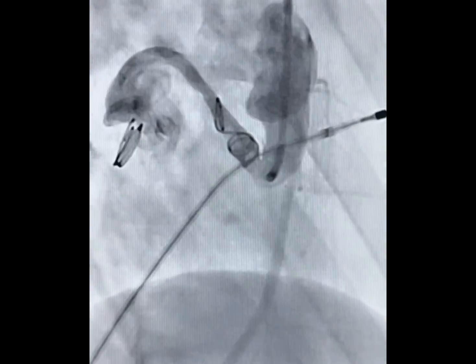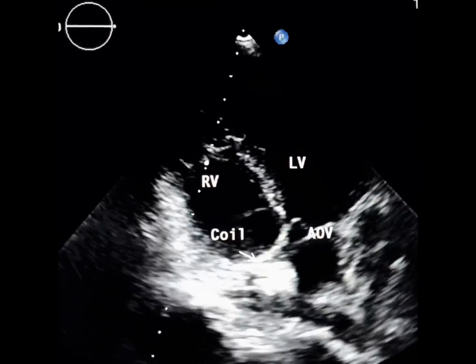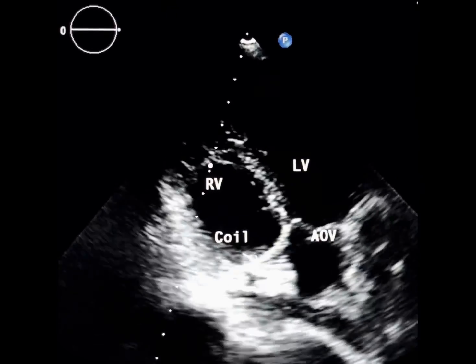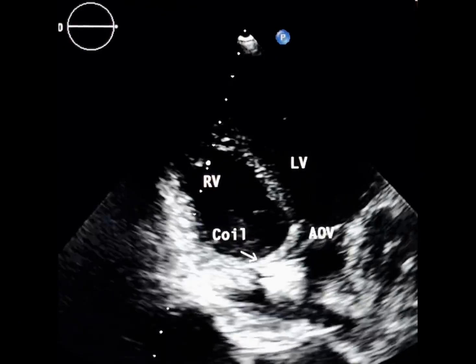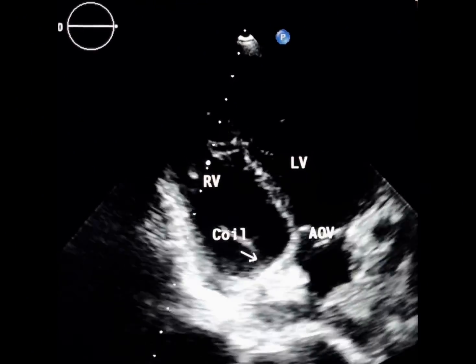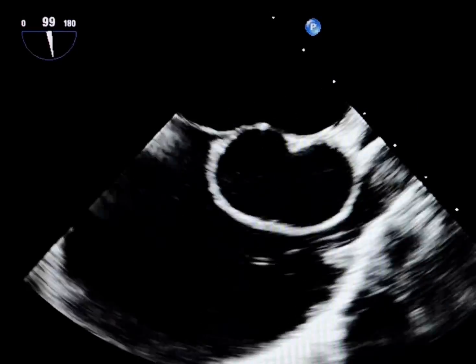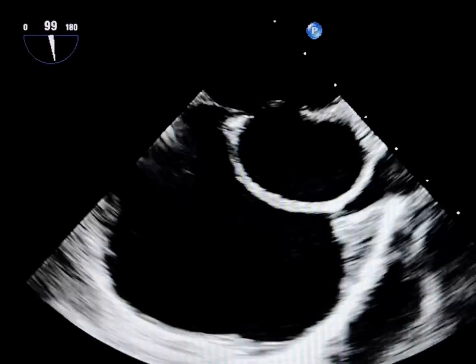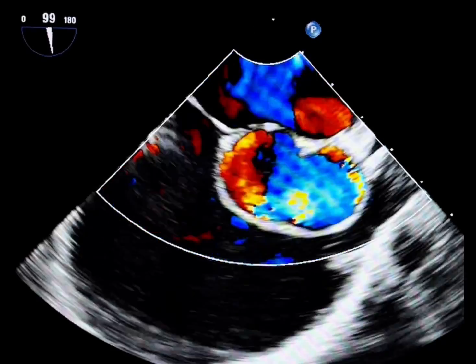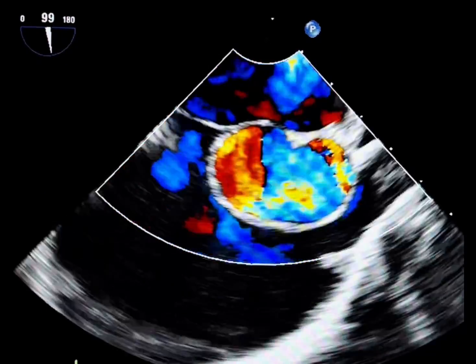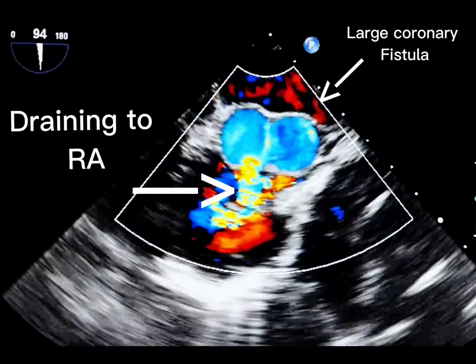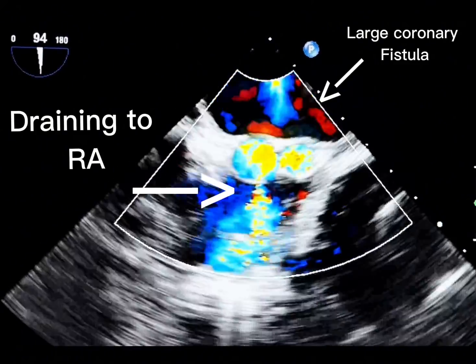This view shows a completely occluded fistula, and post-procedure transthoracic echocardiography confirms successful coronary fistula occlusion. The high-density mass here is the coil. In conclusion, any dilated, tortuous vessel-like mass with continuous flow and a dominant diastolic component should prompt evaluation of a coronary fistula. In this case, the presence of continuous flow was key to the diagnosis.